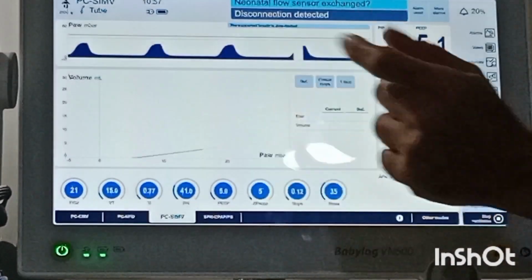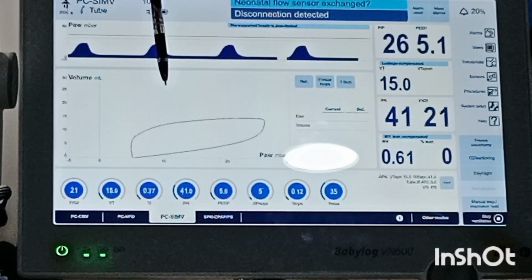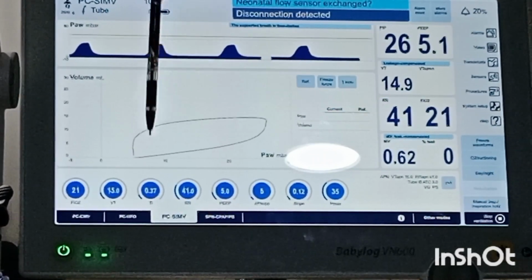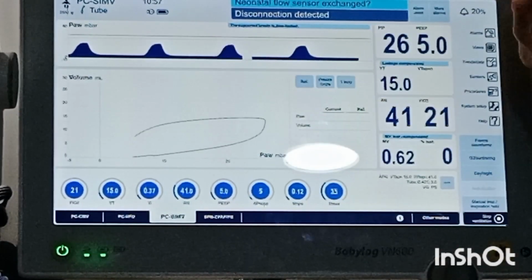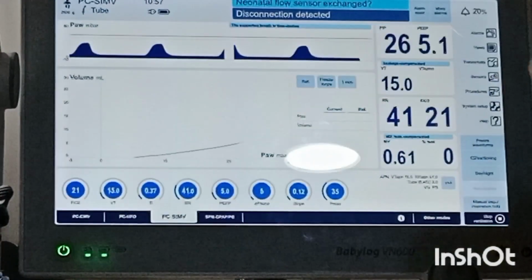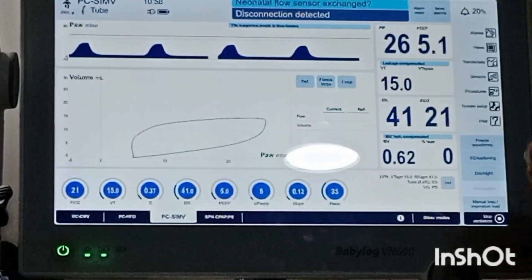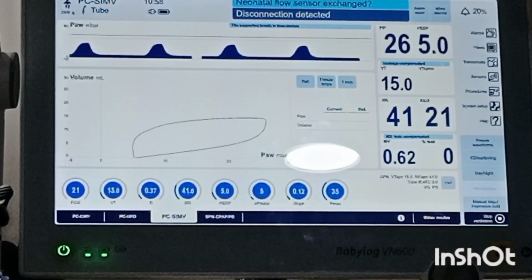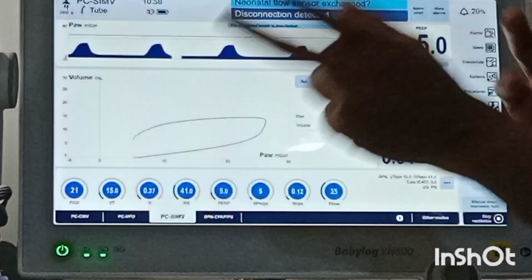It has two important portions. What started towards the bottom is called the low inflection point. The one which is high is called the high inflection point. So you have two important inflection points, and towards the peak you should be careful, because if you leave more at the high inflection point, it will cause hyperdistension. If you go to the lower point, it will cause a low inflection point where adequate compliance has not happened. So you need to keep the compliance between these properly.